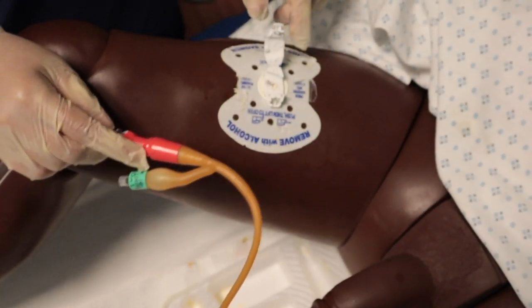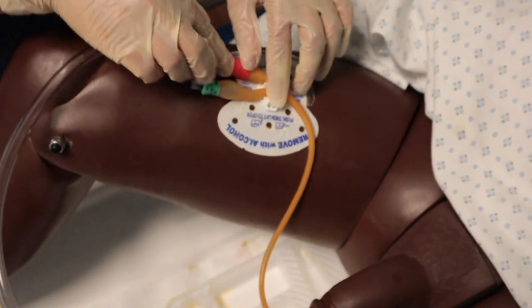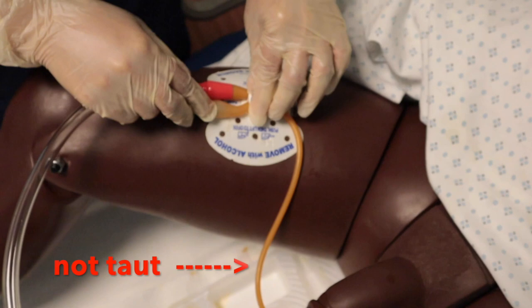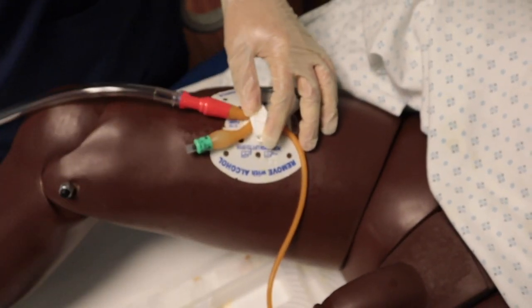Apply the StatLock on the patient's side thigh. Stabilize the bifurcation part onto the Foley StatLock. Close and lock it in place. Make sure the outside rubber tubing is slightly loose and not taut. This allows the patient to move around freely without the catheter tugging.